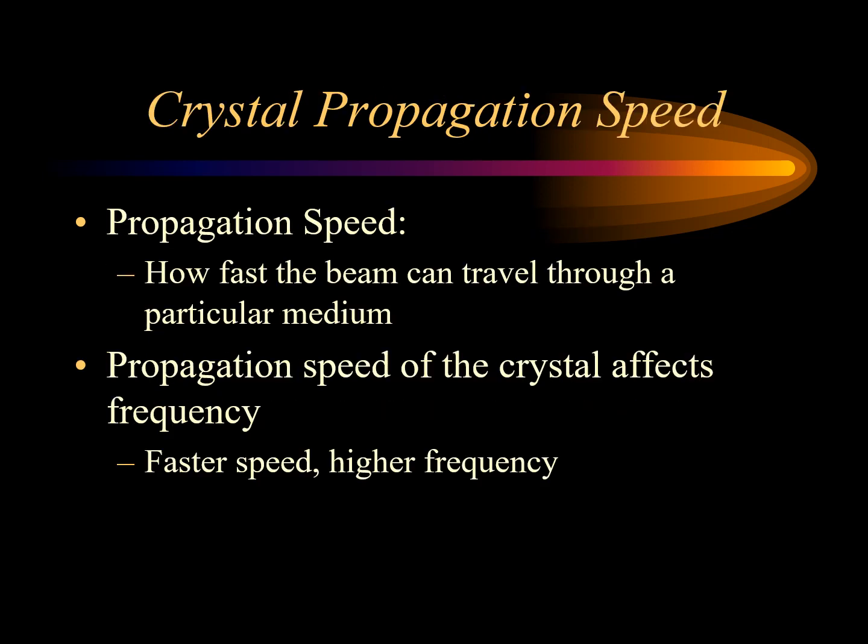Propagation speed is how fast the beam can travel through a particular medium, such as soft tissue, bone, or fluid. Propagation speed of the crystal has a direct relationship with frequency. So the faster the propagation speed, the higher the frequency.